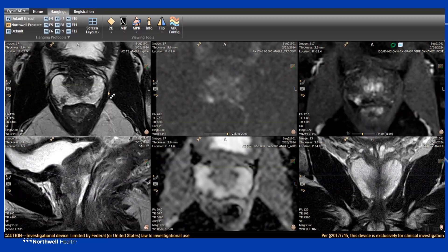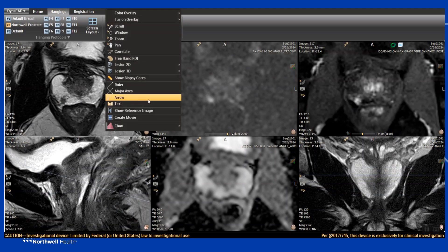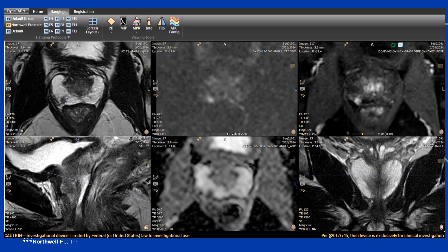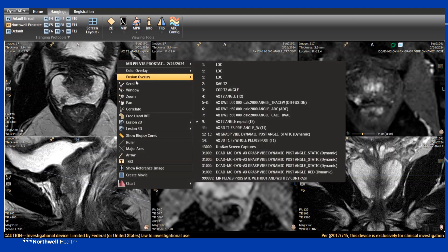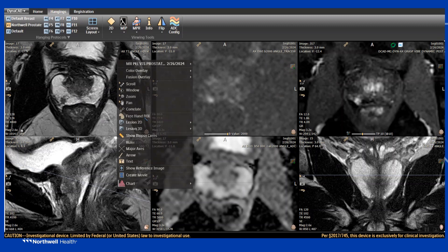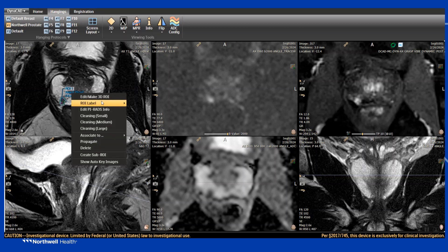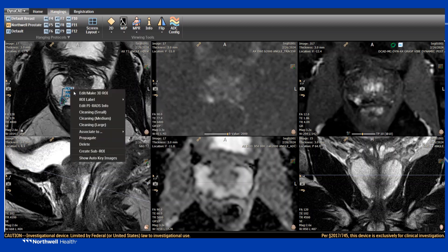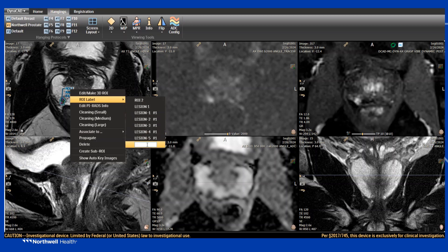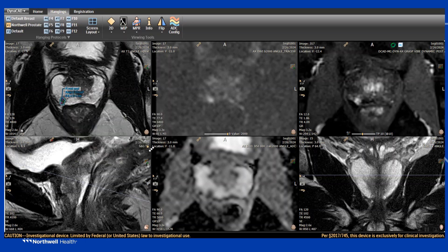Our first step is reviewing the MRI for the segmentation. Hopefully the radiologists have marked it directly on the film, but if not, right-click and select freehand ROI to outline it. We're using the T2 right now. You right-click on it and label it — same label as the radiologist: right, mid, PZ, PL.